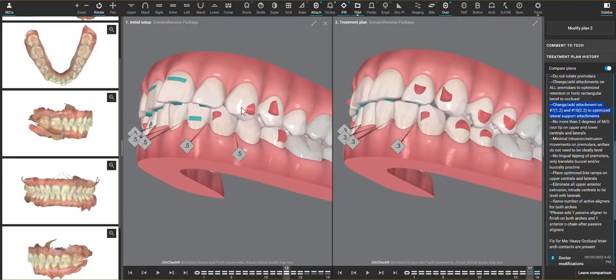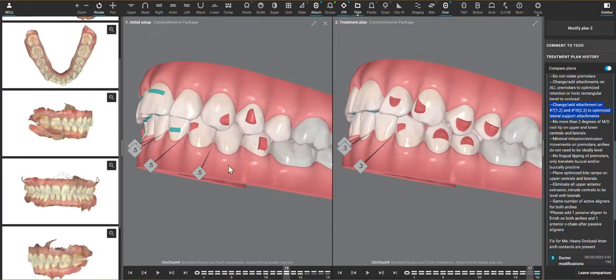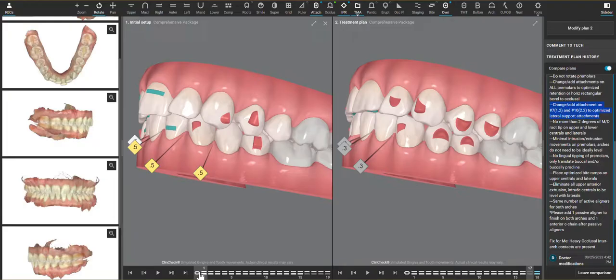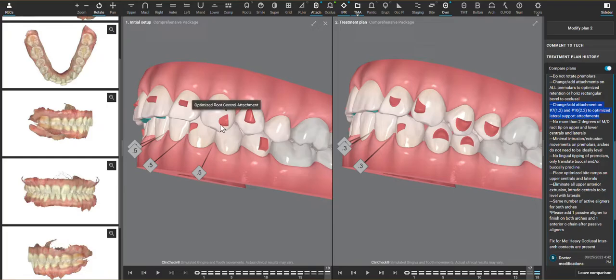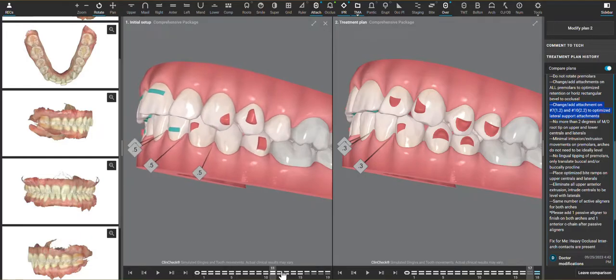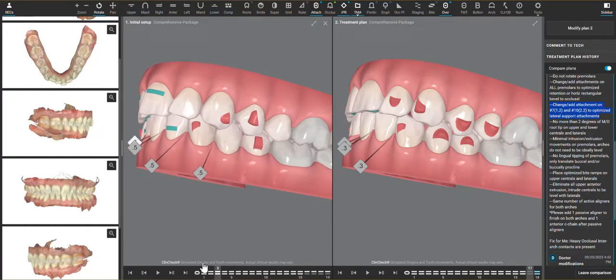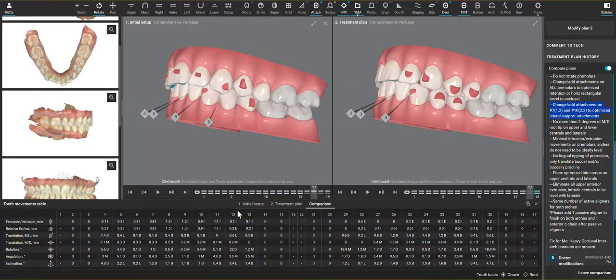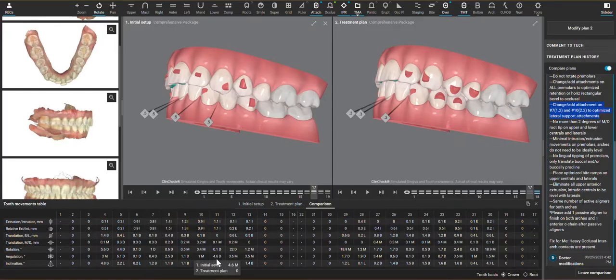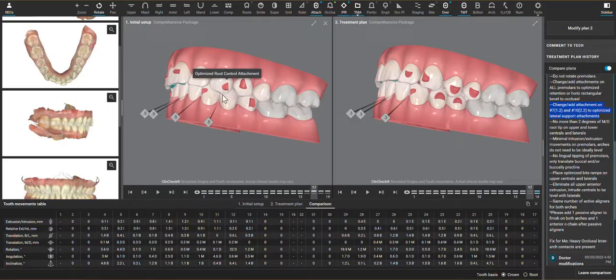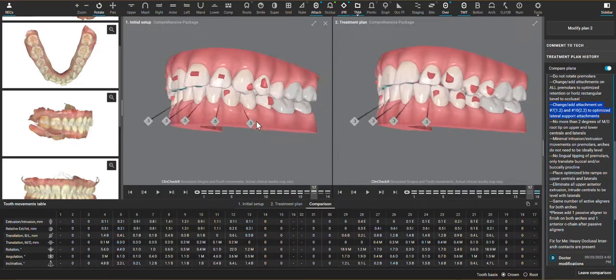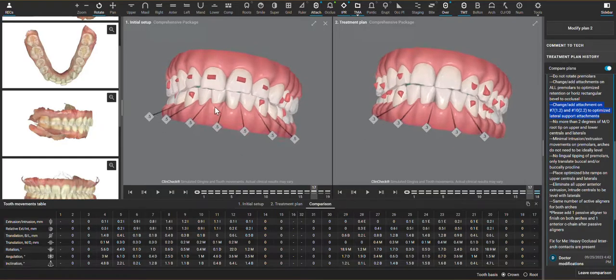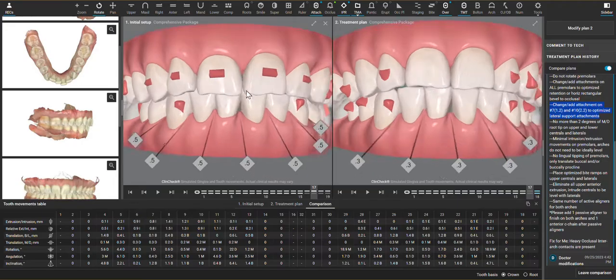The other movements that I eliminated to increase predictability is the crown root angulation, which is planned into this canine. It's not as obvious when you play the case backwards and forwards because I really just see extrusion more than anything, but if there's any bit of this angulation movement planned, then you'll see this root control attachment triggered. It's the correct attachment for that movement, however, that is not a goal of the case, and so eliminating that movement is much more helpful to focus on what we really need.